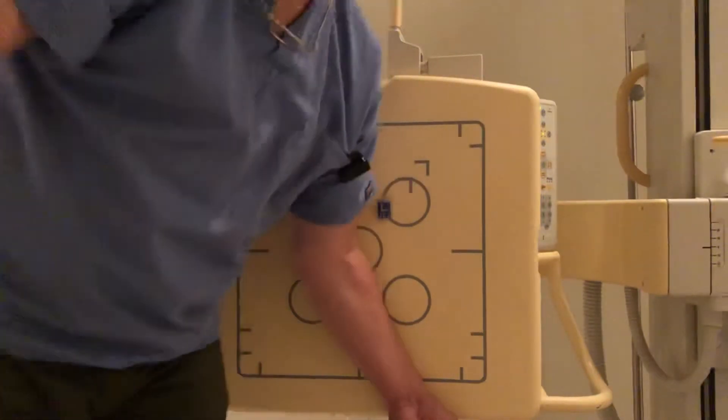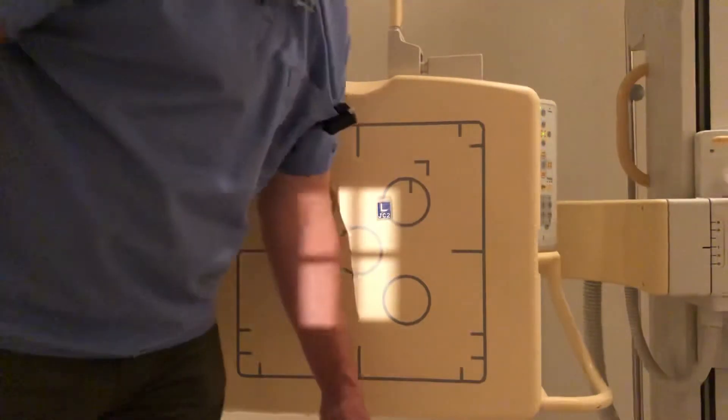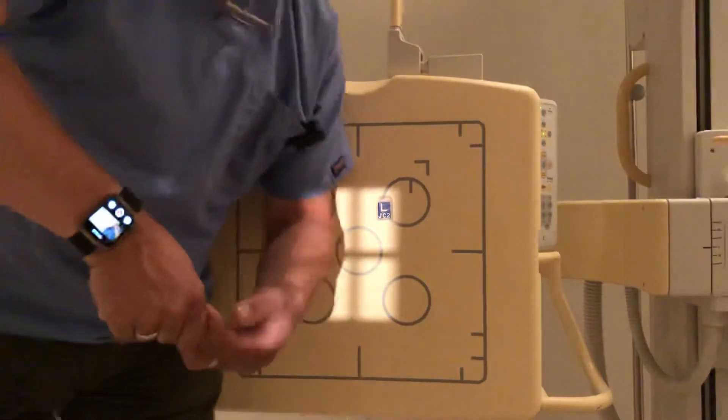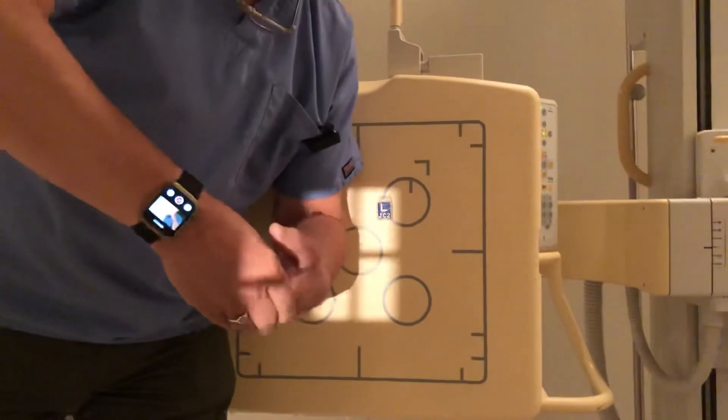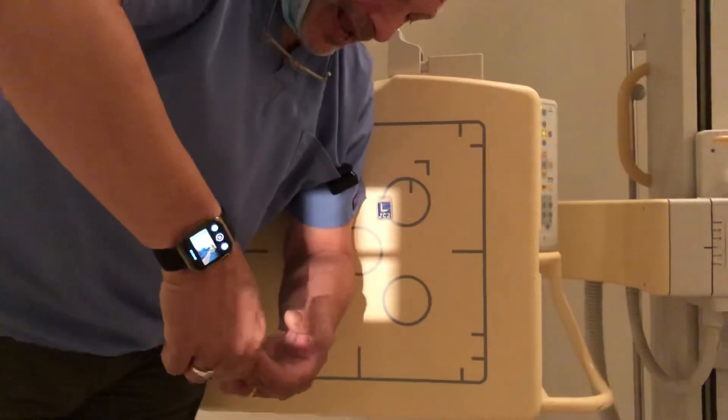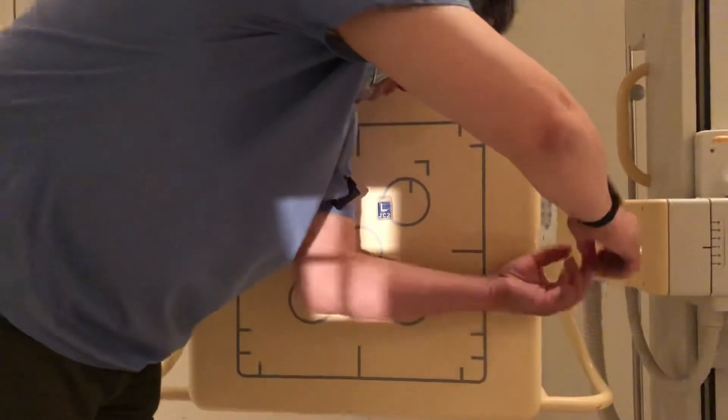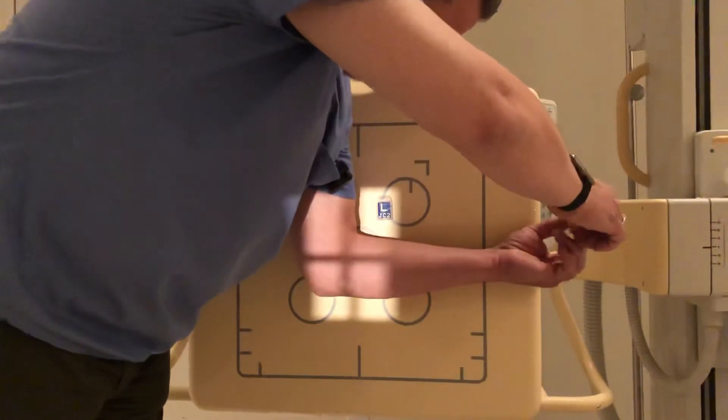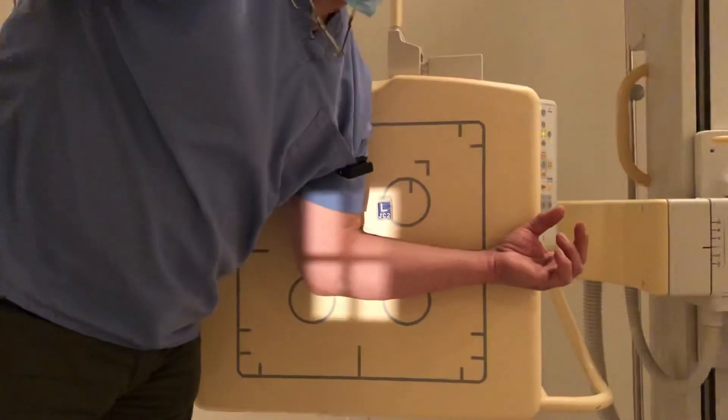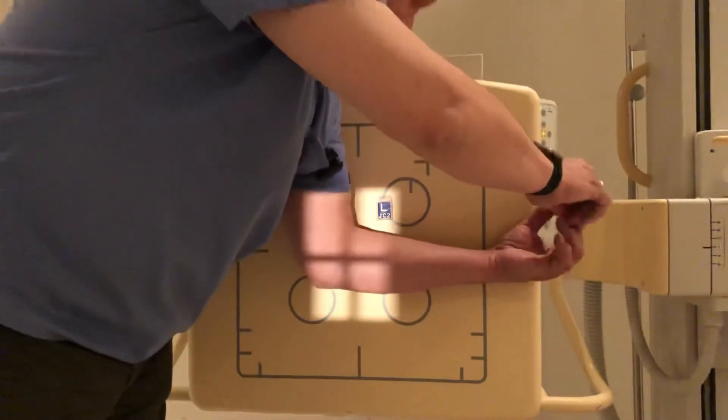And then the last one is going to be, you're going to still have them hold a finger or a hand or a wrist and you're going to rotate everything this way and then bring it out. And they would be holding their hand, but this is what they would be doing.